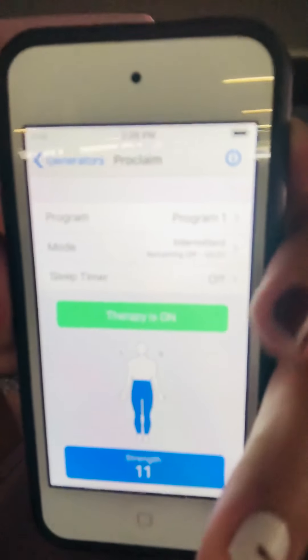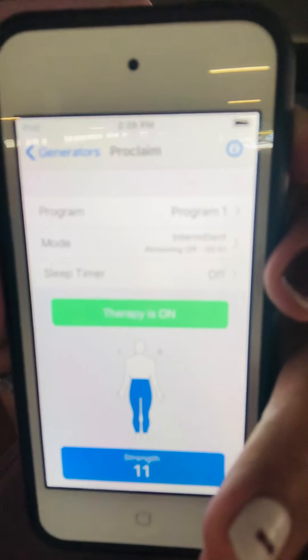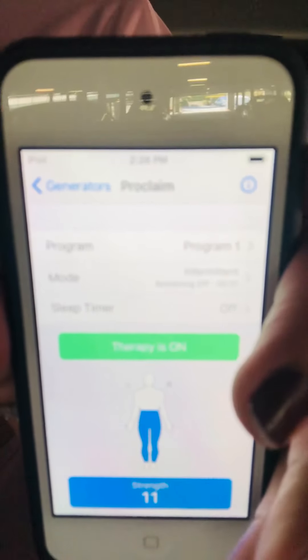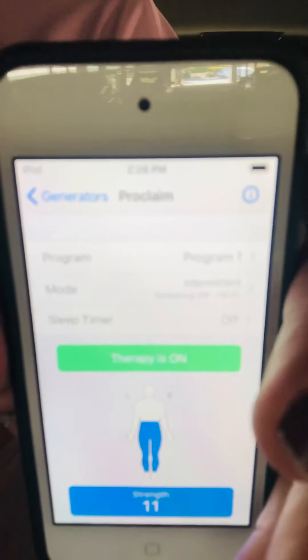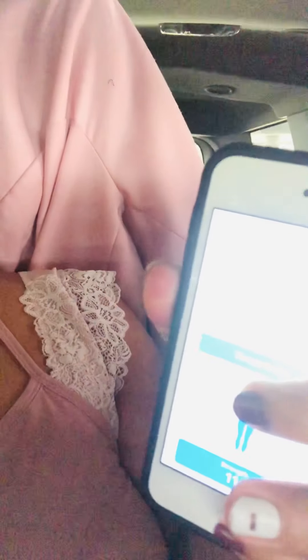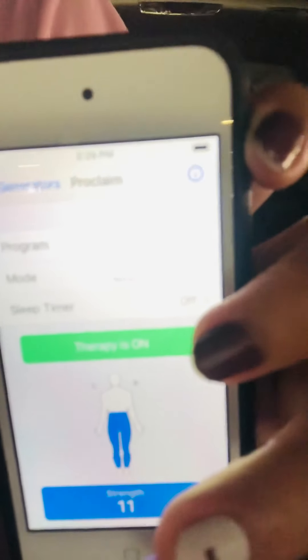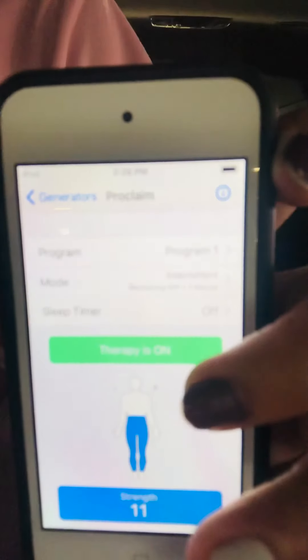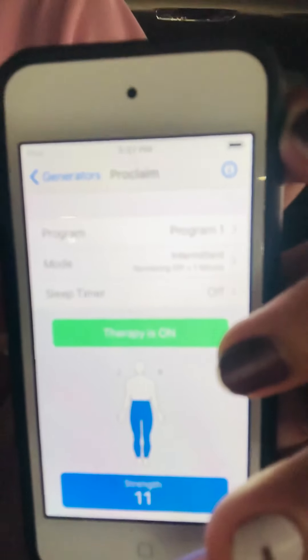Once paired, you'll see the strength display at the bottom. The blue highlighted area represents from the waist down, which is where my pain is. If your pain is in the upper area, the lead is placed at the back upper part, but the therapy still covers from the waist down because that's where my pain is.